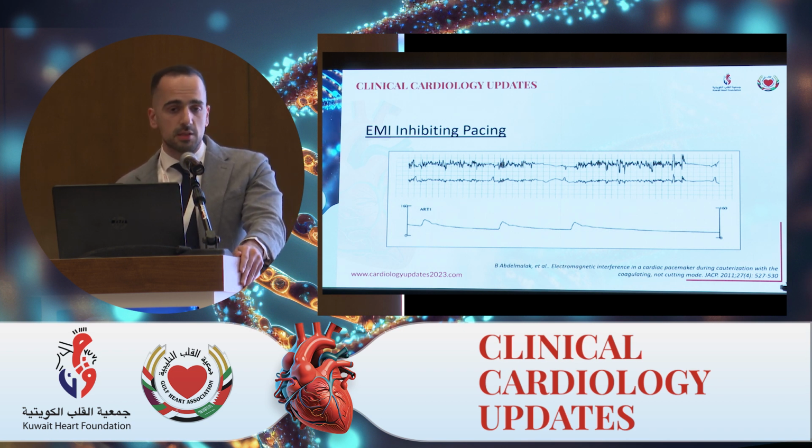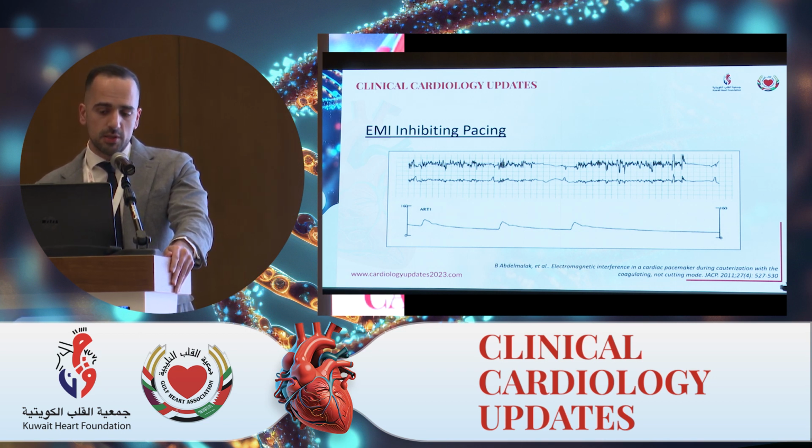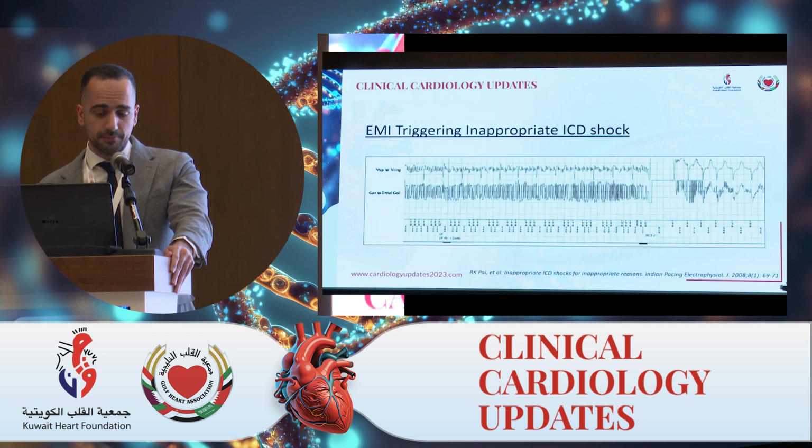However, if the anesthesiologist is paying attention or the surgeon's paying attention, as soon as you come off cautery, everything will go back to normal. But this is just to highlight how electromagnetic interference can interfere with a pacemaker's function. And here is an example of electromagnetic interference doing the opposite and triggering an ICD shock. Same situation. A lot of noise will be picked up by the lead. It can't tell if this is artifact or not, so it'll do what it's programmed to do, which is shock.